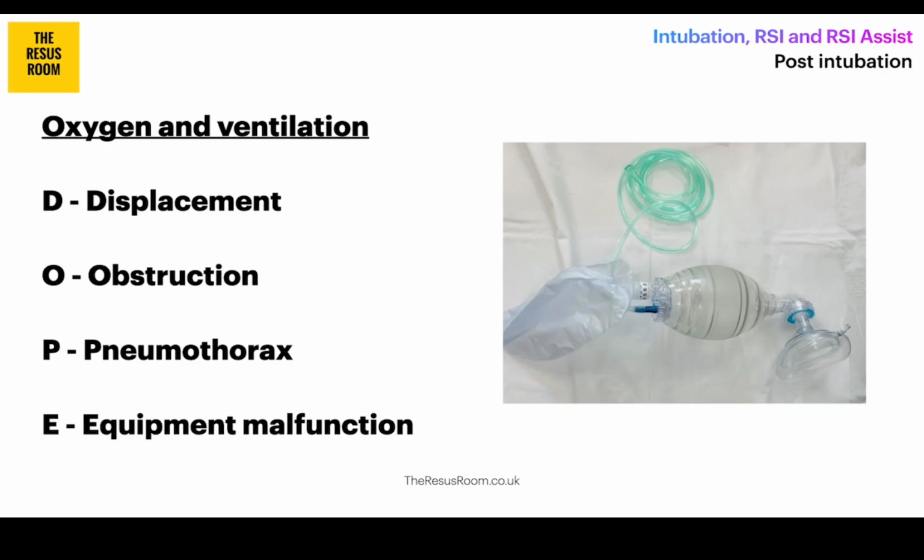So once you are attached, if there is high or low ventilatory pressures when you're squeezing that bag or that Mapleson circuit, think about the DOPE mnemonic to troubleshoot. The awesome thing about this is it also applies to troubleshooting the ventilator.